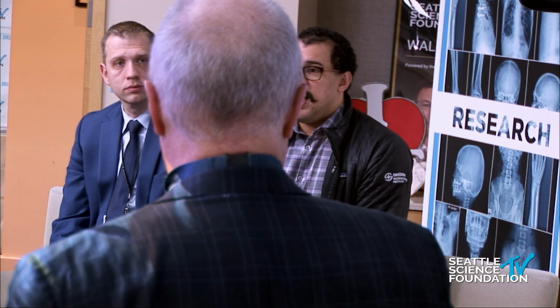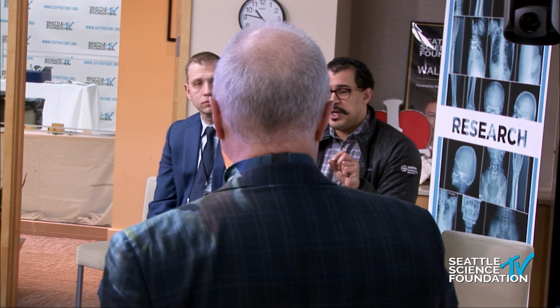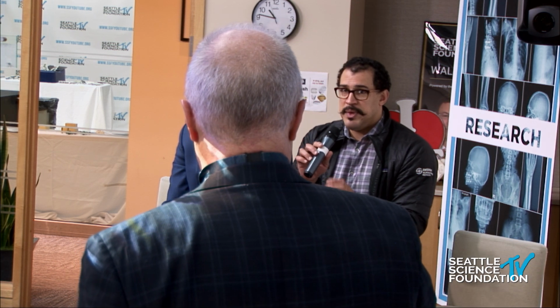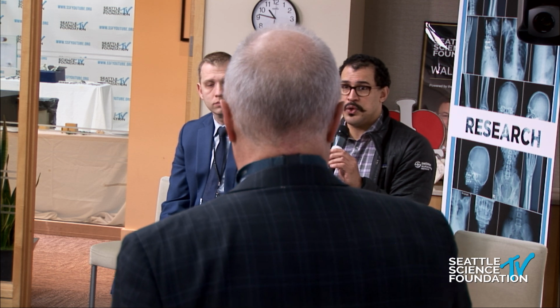And I think that one of the challenges when you're doing the pre-cementation is timing, where you're having to get the appropriate amount in, get the screw in before it hardens. And sometimes if you put that cement in too soon, the screw itself can cause the extravasation by kind of pushing it out. I don't think that there's one that's better or worse. I think it's a matter of preference.